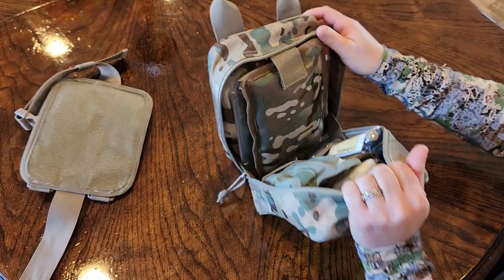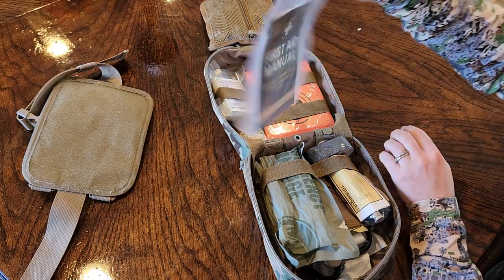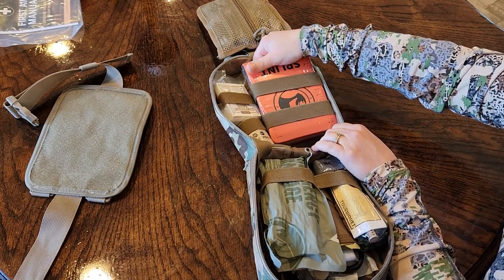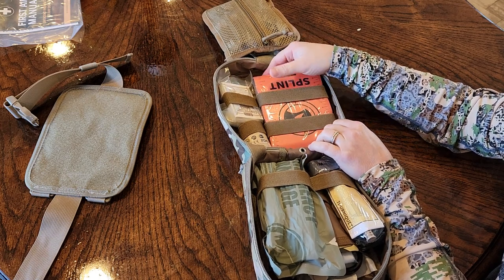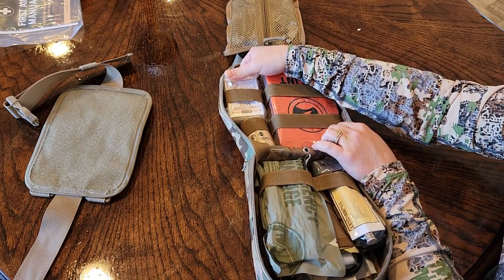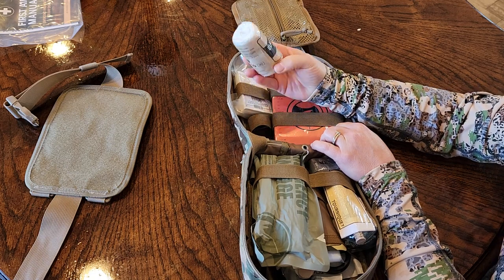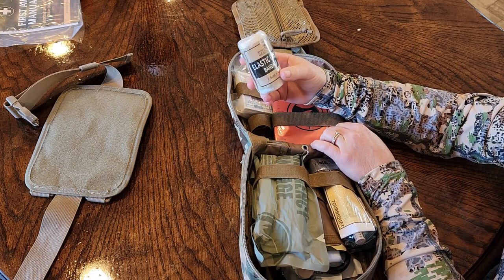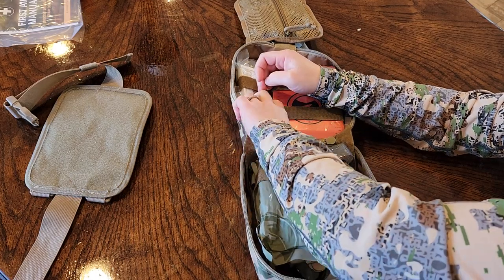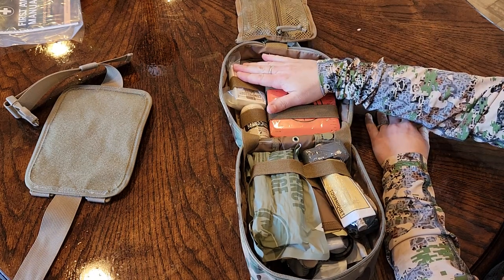They do. So it is a single compartment IFAK on the outside. Inside, multiple little layers. Of course, your first aid manual. And you got your splint in this one. It's good for immobilization for your joints, arms particularly. And then on this side, you've got your compression gauze for securing that uncontrollable bleeding sometimes. And then this looks like it's just an elastic bandage, a gauze that wraps around like an ace wrap, to help hold the pressure over the wound. And that's kind of how the order goes. Immobilize, apply the gauze to the wound, and wrap it up.